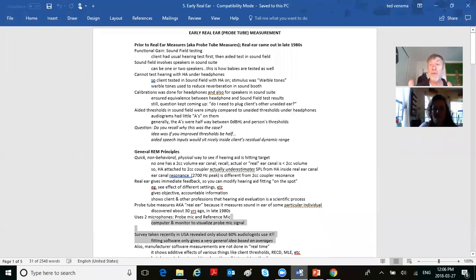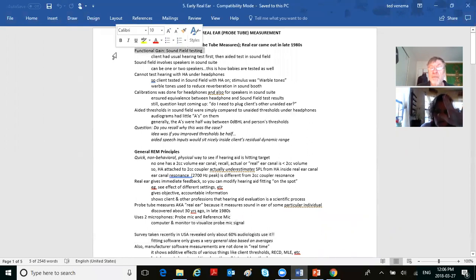You looked at the PowerPoint slides. Now let's highlight the points that we need to have in mind so that we've got early real ear bagged and done. So, functional gain, memorize it. Put a star by it.